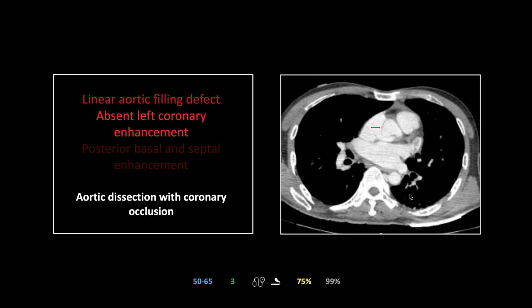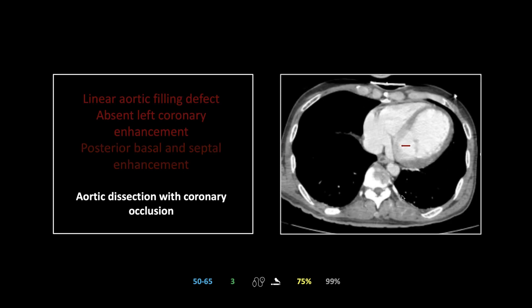This case shows the great complication of aortic dissections. You can see the linear filling defect, and look at the left posterior aspect of the aortic root — that linear filling defect is passing right across the left coronary ostium. The left main and LAD show no enhancement. There is normal enhancement of the myocardium in the posterior basal and basal septum, but the rest of the left ventricle is hypodense and under-perfused — the distribution of that left coronary.